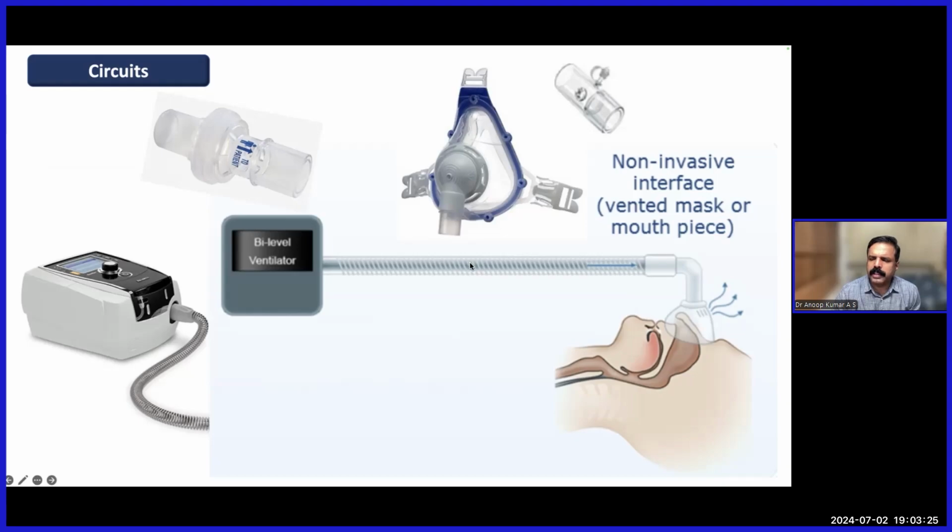So that is maintained by the pressure during expiration, or the EPAP. So you need a basic EPAP of at least 5 centimeters when you are using an NIV, because you need that pressure to push out the exhaled gases. That is a common doubt we all have. Suppose the patient is having CO2 retention, type 2 respiratory failure, why do we need an EPAP? An IPAP is enough, so that you can have a higher pressure support and higher tidal volume. That concept is completely wrong. As I've already mentioned, you need a continuous pressure to push the exhaled air out.